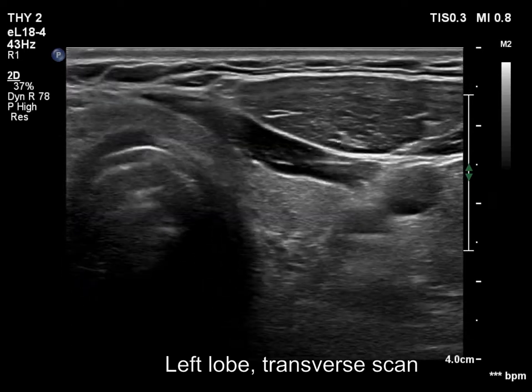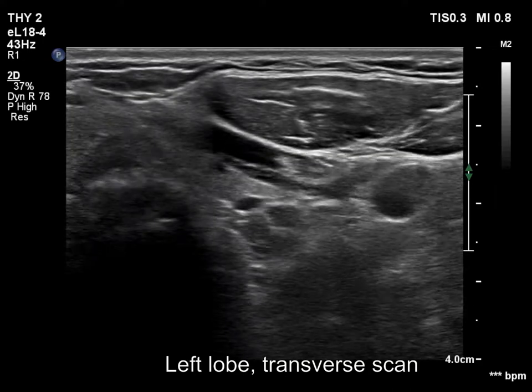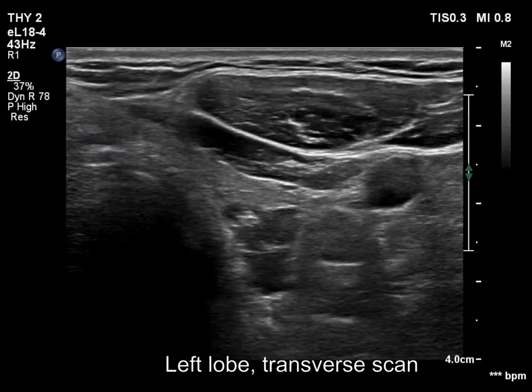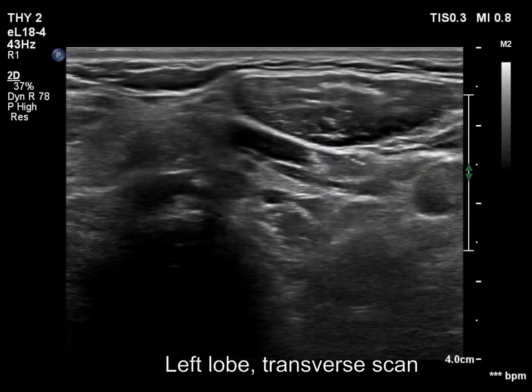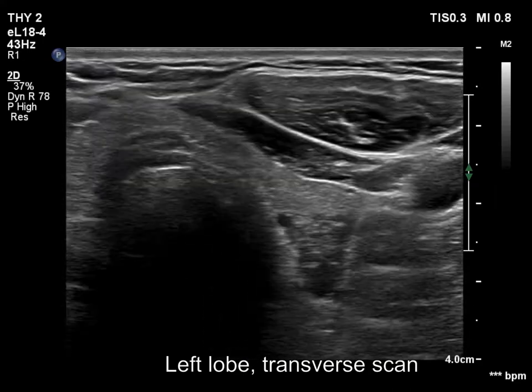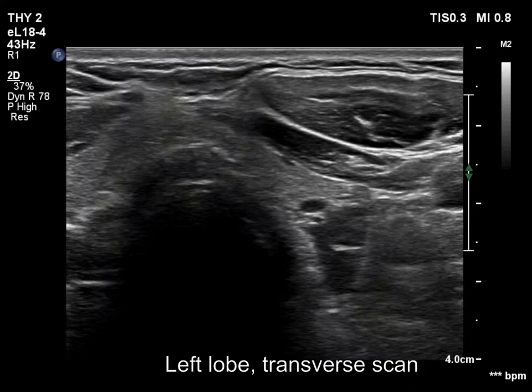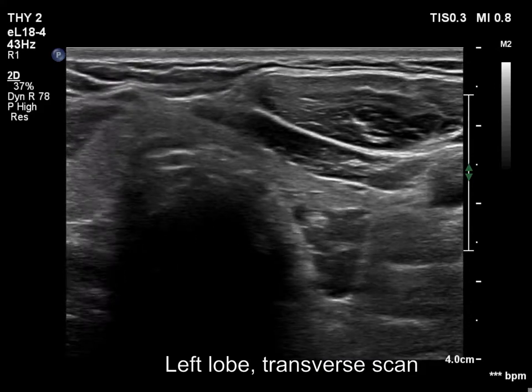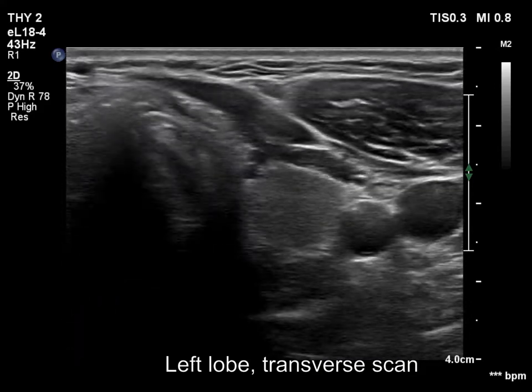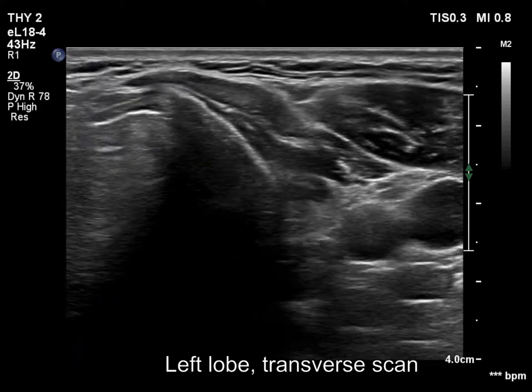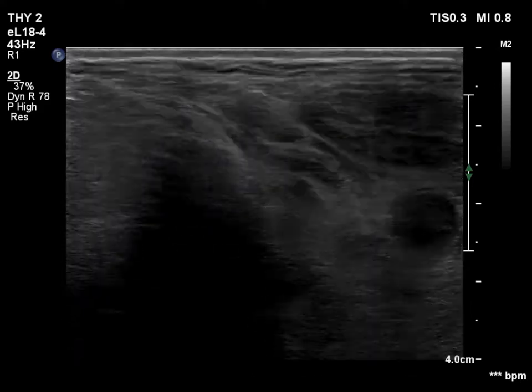We start the scanning from the upper part of the left lobe. Note another hypoechoic lesion in the ventromedial part of the lobe.